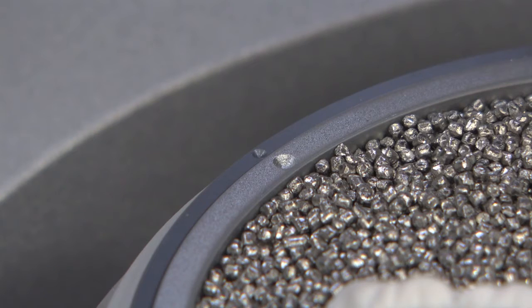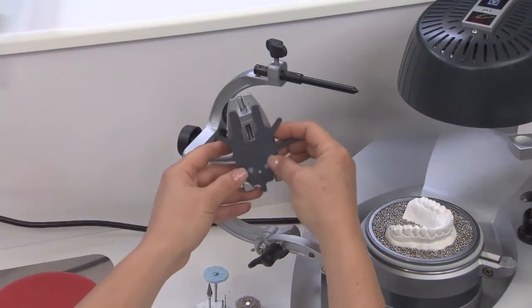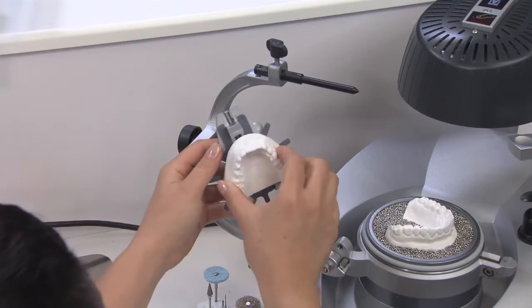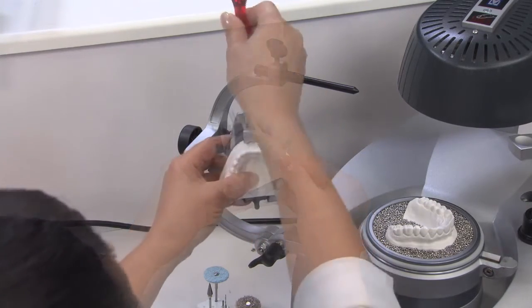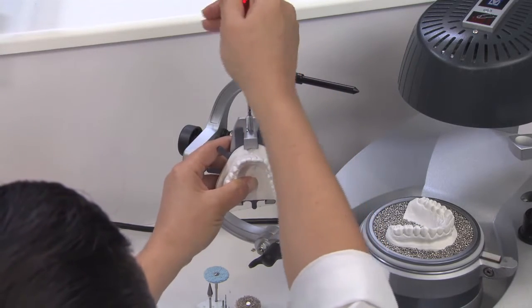Verify that the dot on the pot and the dot on the left side of the thermoforming chamber line up. Now, install the face chuck onto the Occliform model mount, followed by the model. Tighten the model to the model mount, securing both the model and the face chuck.